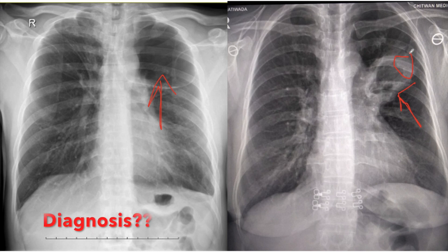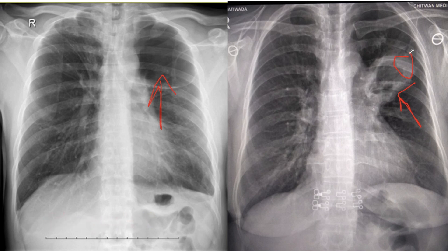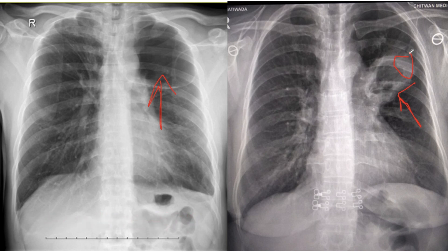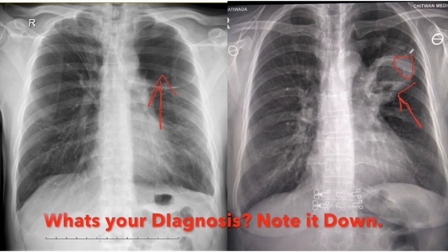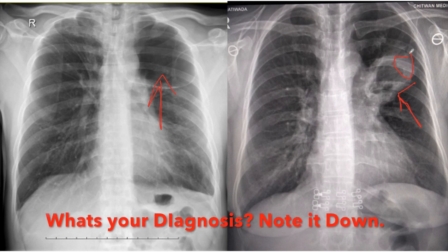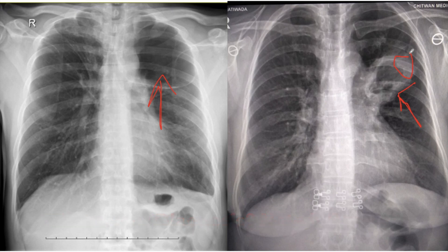What is the diagnosis in both these cases? Is it cavity, bulla, pneumatocele, or bronchiectasis? Pause this video for a few seconds to write your opinion on a piece of paper for both these cases, and then proceed with the video to check if you are correct.